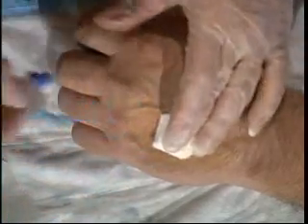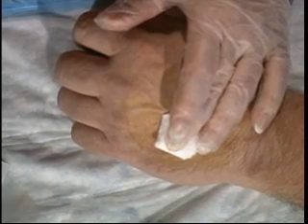Gently retract on the catheter and remove it. You should tell the patient now that, again, the procedure is completed. When you pull the catheter, always look at the length of your catheter. You recall earlier that we talked about the length of the catheter. I want to make sure that it was truly 3/4 of an inch when it was inserted. I want to make sure that it's 3/4 of an inch long when I remove it. So again, I just make sure and determine that my length is the correct amount before I discard it.